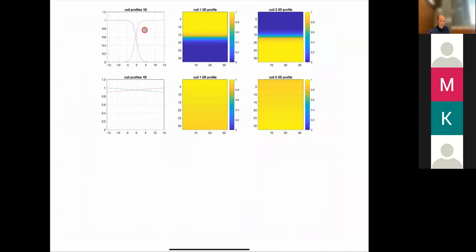It turns out that this is also better for GRAPPA, because each of these is narrow, so it has a pretty broad Fourier transform. So there's a lot of smoothing in k-space, and the assumption that I can predict this point from its neighbor points is better than if I look at this. This is almost just flat. In the limit, it would just be a delta function, so neighboring points in k-space don't really tell me much about this point, and I can't predict it very well.